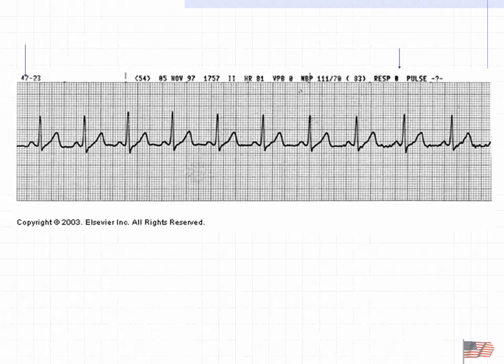What it'll be on the test is, I have a strip. What's the heart rate? Now, you can see this little vertical line here. If you have one of them and you have another of them which is off the page, that is 6 seconds. Each distance between those little vertical lines is 3 seconds. Find two of them and count the number of beats between.